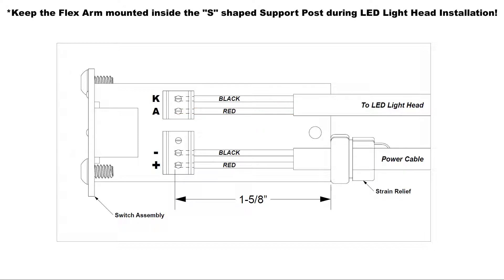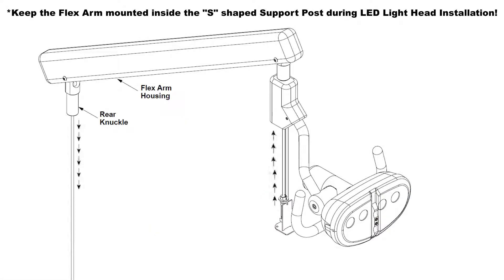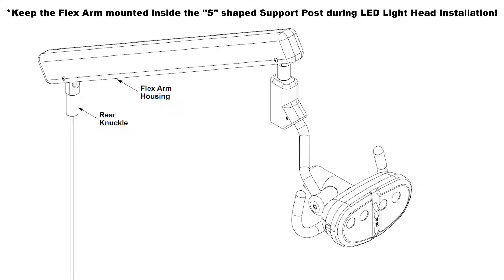Slide the strain relief onto the LED wiring harness and align the wider end of the strain relief to the edge of the switch assembly, leaving 1 and 5 eighths inch of wire between the terminal connection points and the point where the strain relief and switch assembly PCB meet. While ensuring the strain relief is making contact with the edge of the switch assembly, secure the washer onto the strain relief. Pull the 8 inches of cable slack through the flex arm and mount the wired switch assembly to the LED light assembly using the button head screws.